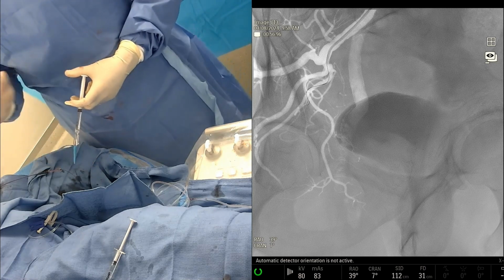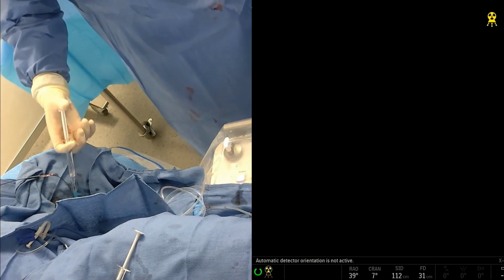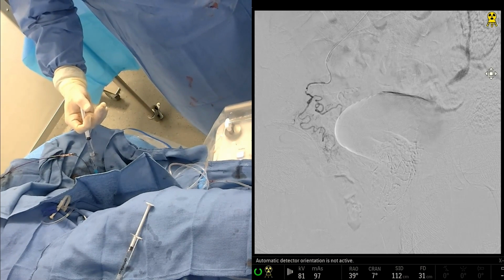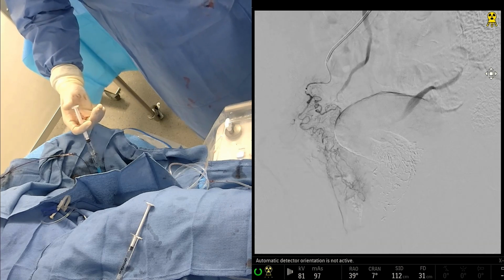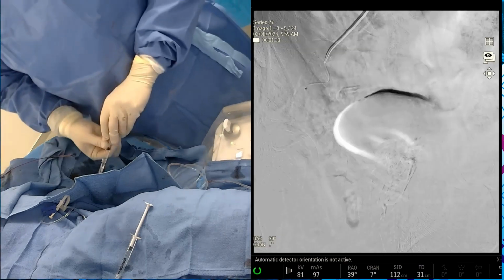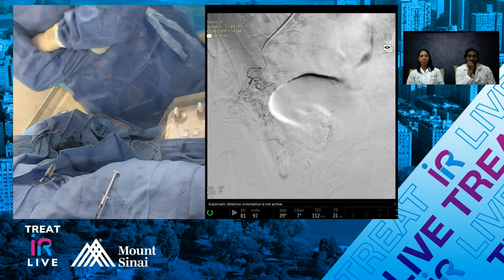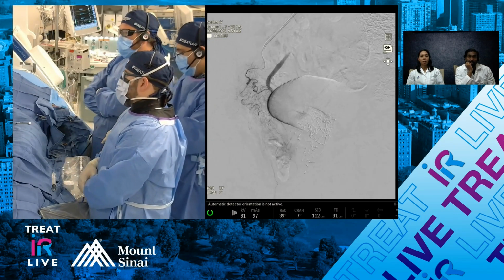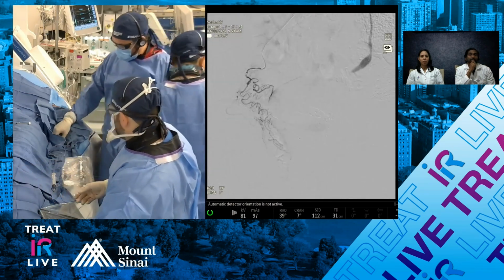When we see two vessels that look like the prostate, the one that's posterior is usually the rectal. They both have an S shape, but we'll see. Oh, no, that looks rectal. Definitely rectal. I don't think you need a cone beam CT for that. There may be a little prostate off of there at the bottom, but that very straight, medial-going branch is fairly rectal characteristic. And the other option you have is glue on the other side, what Aaron was saying, the poor man's puff back.